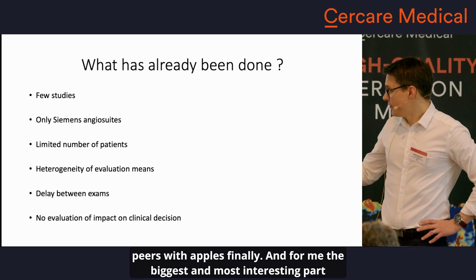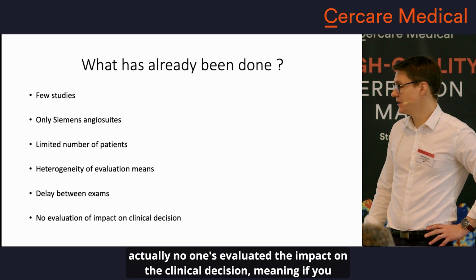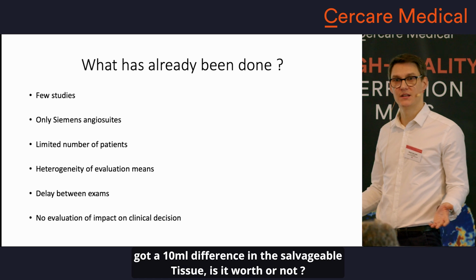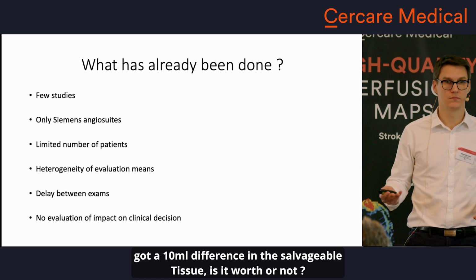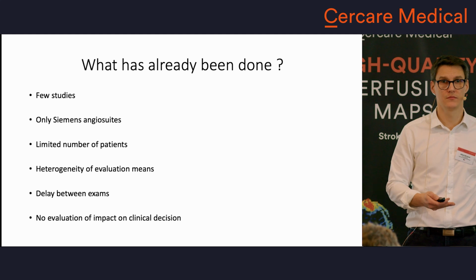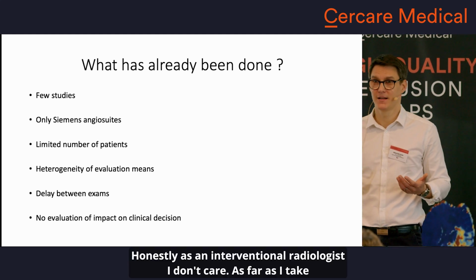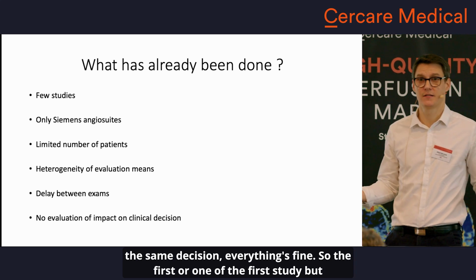And for me, the biggest and most interesting part, actually no one has evaluated the impact on the clinical decision, meaning if you got a 10 milliliter difference in the salvageable tissue, is it worth it or not? Honestly, as an interventional radiologist, I don't care. As long as I take the same decision, everything's fine.